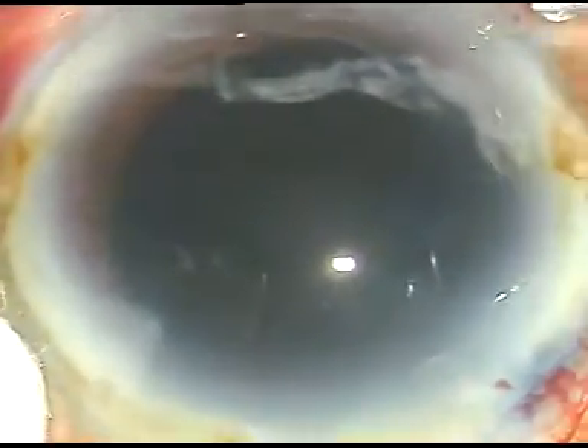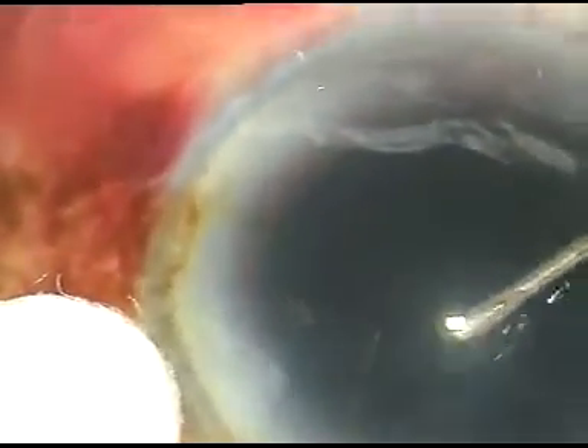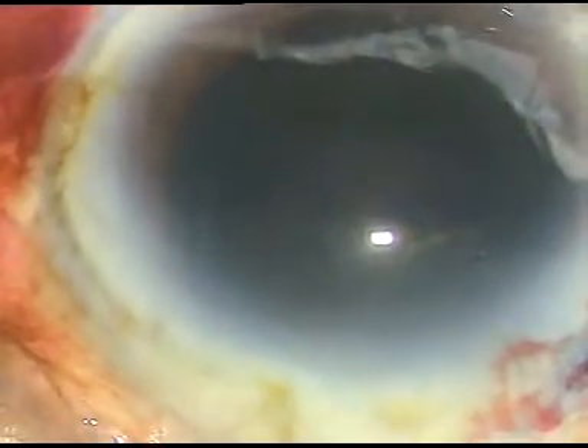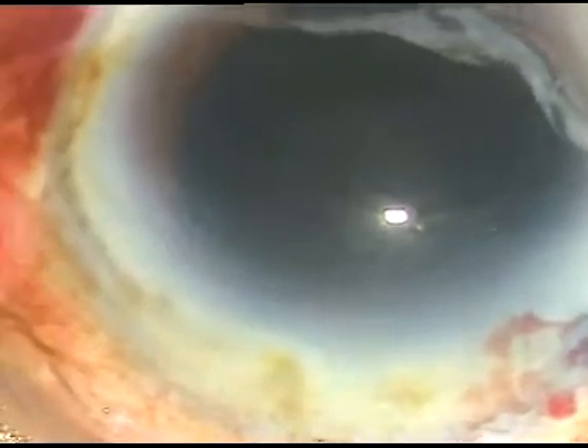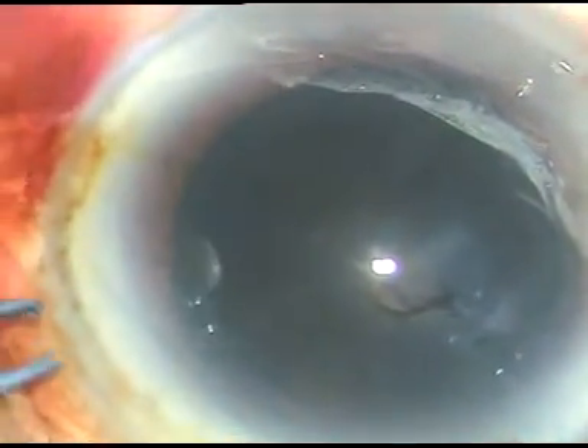Dear colleagues, this is a hard black cataract. In Latin, we call it cataracta nigra. In this edited portion of phacoemulsification of this cataract, I want to discuss the safety measures that we should keep in our mind while managing this hard nucleus.